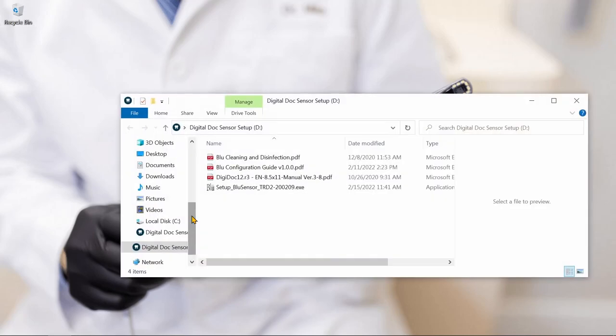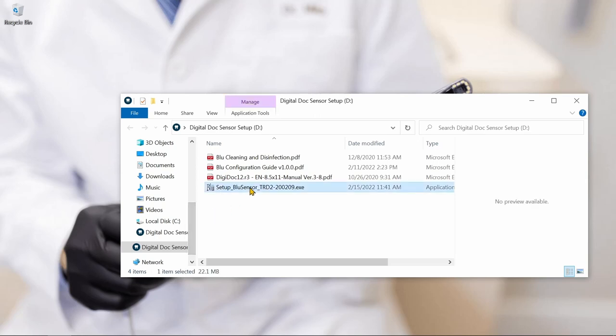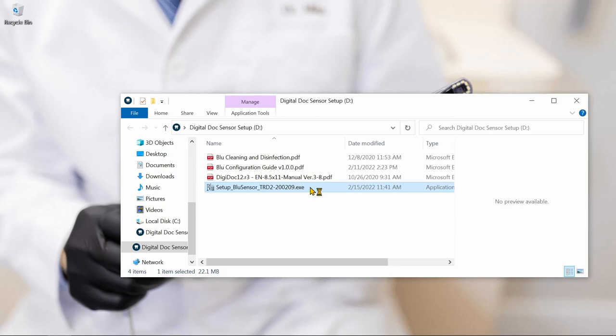Each individual sensor will come with a flash drive, which will contain the installer file for that specific serial number and other information about your sensor.